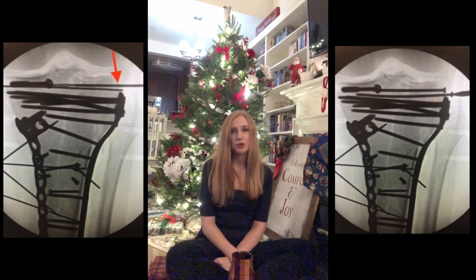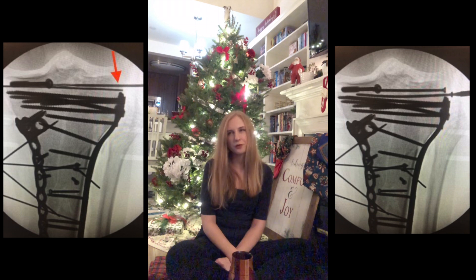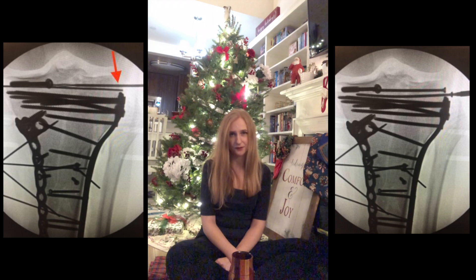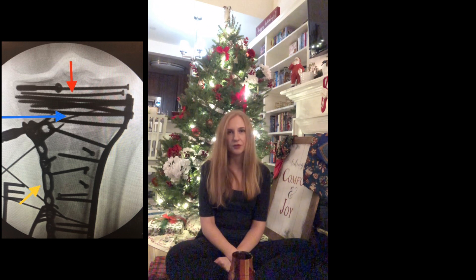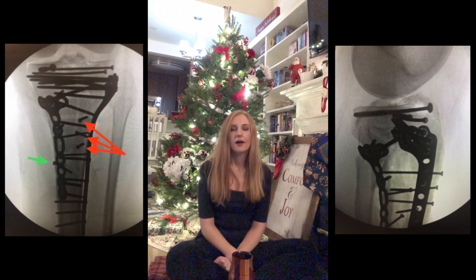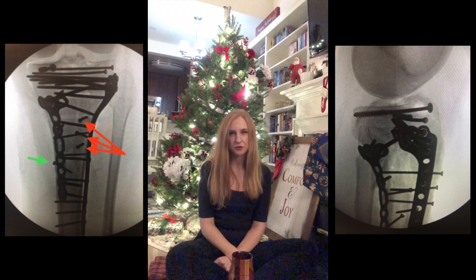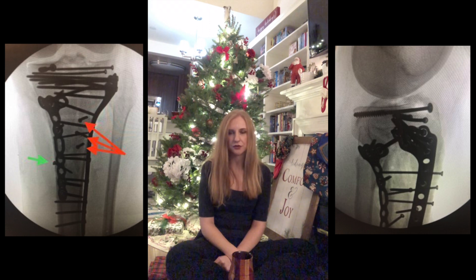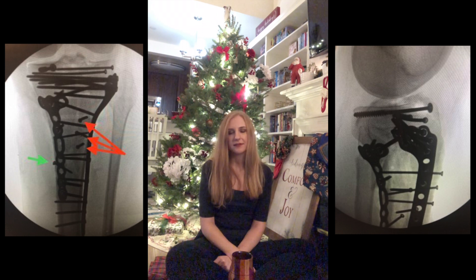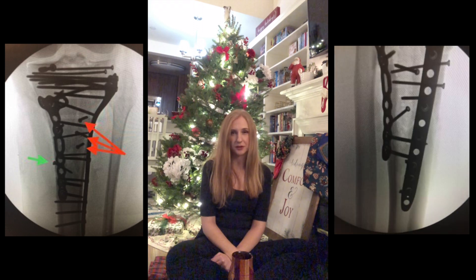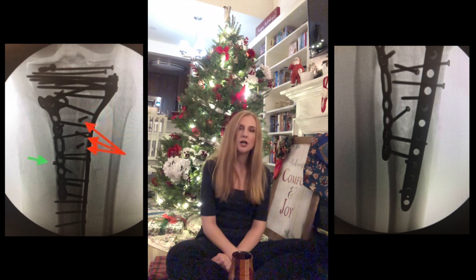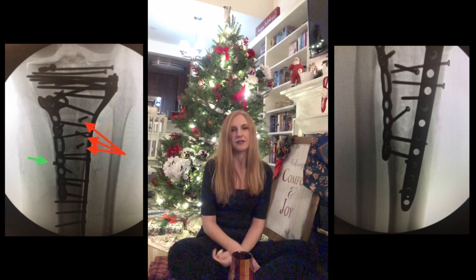Here you can see my rafting screws going in — these were 2.7 screws, relatively small and bendable, so I can maneuver them around all the other points of fixation. These are the final positions of the rafting screws in red. Now I'm going back to the medial side to take out those temporary screws and put in longer ones. These are the final images showing the lag screws in red and green being added to support some of the cortical fragments — and now you can see the whole reconstruction. One caution: don't end your plates in the same place, as that creates a stress riser. I try to make one plate longer than the other — in this case, the lateral plate.